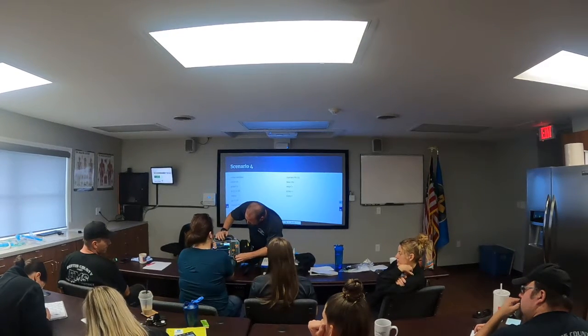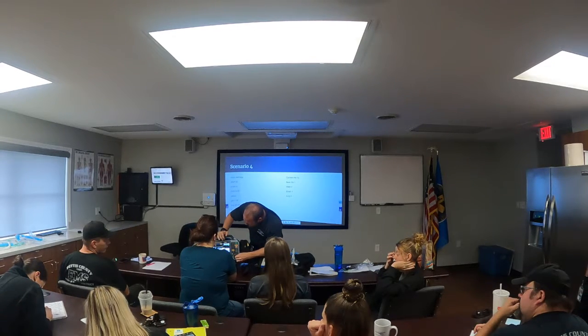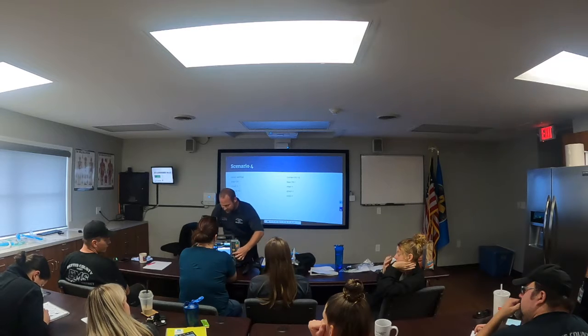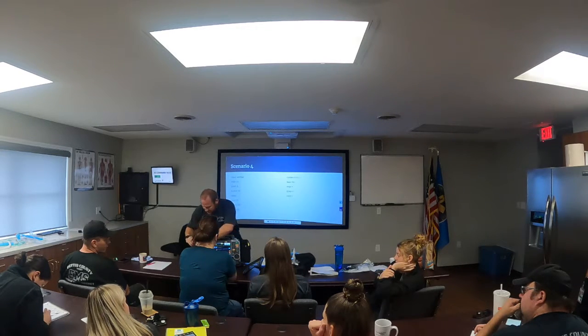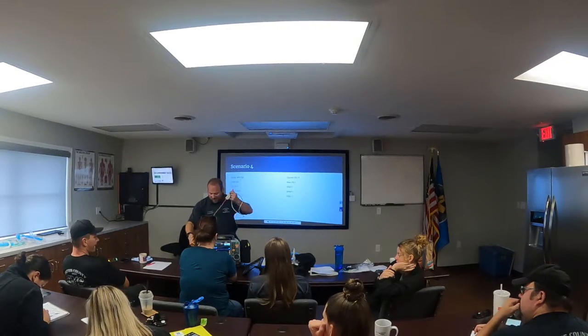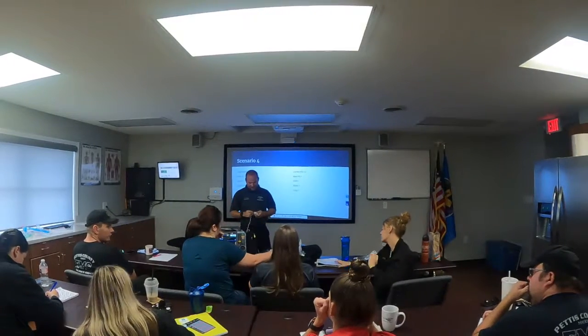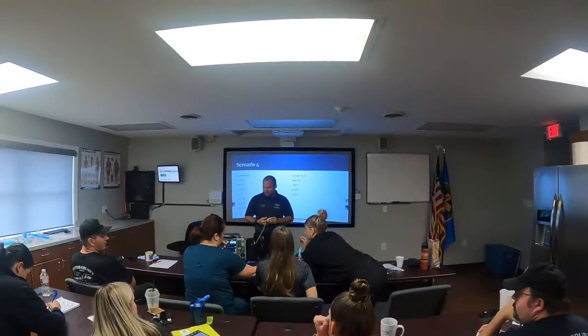I like to set up, when I have one inside, I like to set up my SpO2 and my waveform. Okay, so if you're going to set up BiPAP, go ahead and put in your initial settings. You guys do it. Get it green.